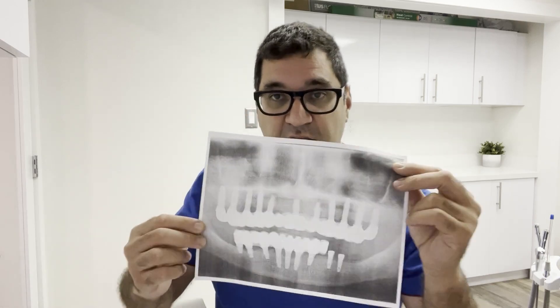Now, all-on-four is just about as good as this, but if you want the Lamborghini — the very best — full mouth dental implants is what you want. So let's discuss what it takes to do a case like this. This patient has about 11 implants on top and 9 implants on the bottom — about 20 implants total.